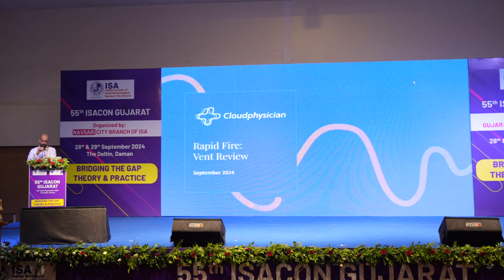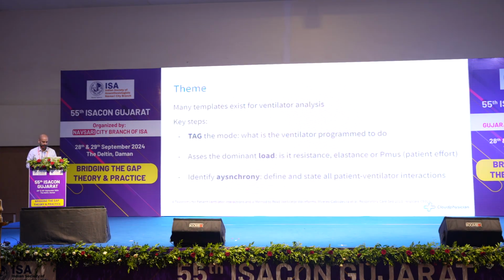Sorry for the technical difficulties, but we're on track. So this is the aim. What I'd like to talk to you about is that there are a lot of templates in ventilator analysis, but this is a recently published one in 2021 as a result of about 20 years of work from one of my mentors, and makes it pretty straightforward and easy for you to analyze any abnormality that you see on a ventilator screen, regardless of the manufacturer.